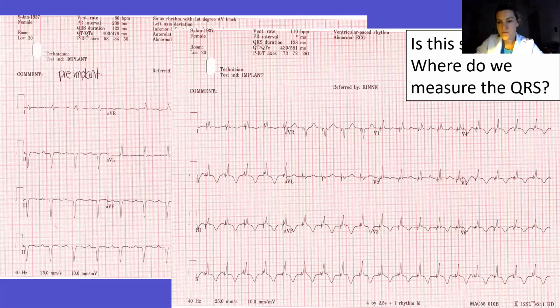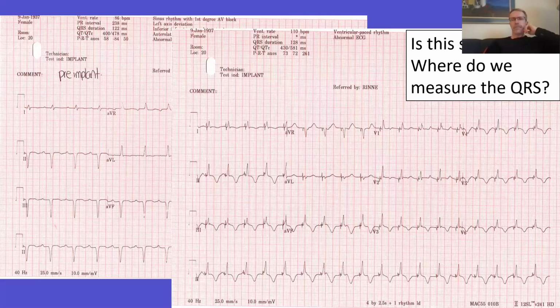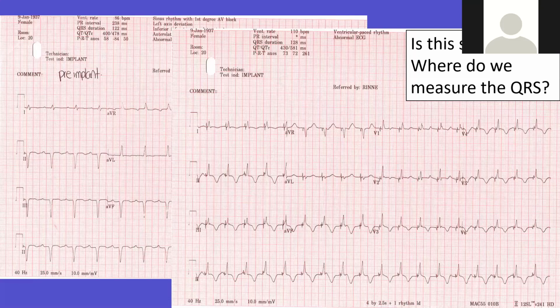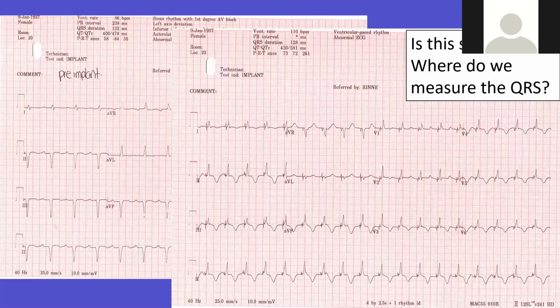Look at this. I think these ECGs are cool. It shows the T-wave memory of the prior QRS. If you look at 2, 3 and AVF, they have Q waves and the QRS is negative. If you flip back to the ECG with the pacing, the T waves are negative where the QRS was negative previously. It's kind of cool.